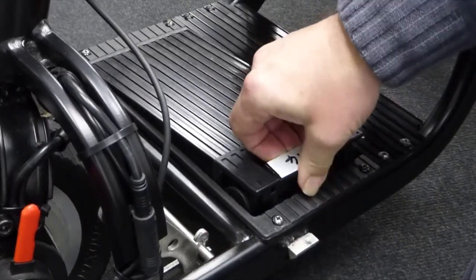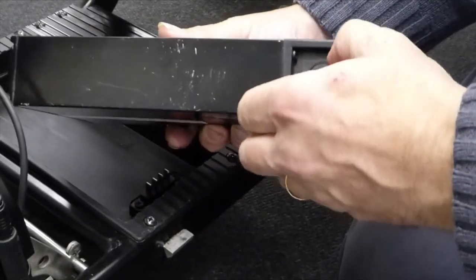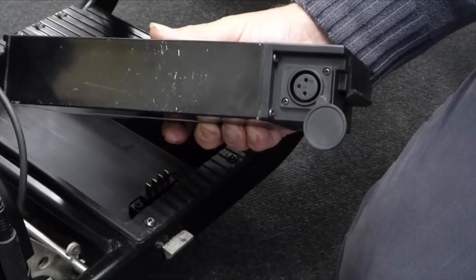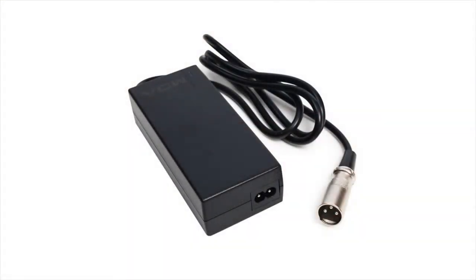To charge the e-folding light, simply remove the battery by lifting it out and connect the supplied charger to the port on the side. Only use the charger supplied with your e-folding light. Using unauthorized chargers may damage your battery and invalidate your warranty.